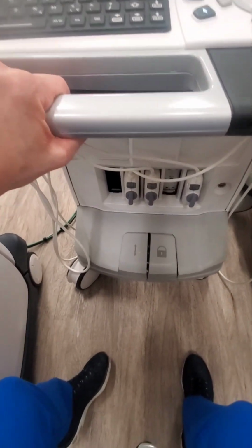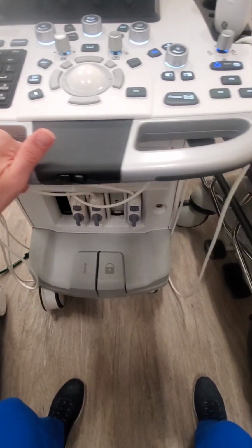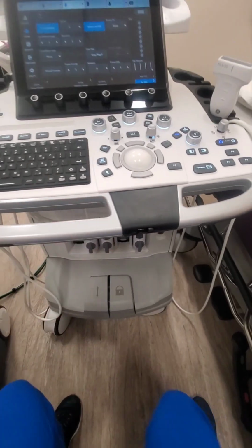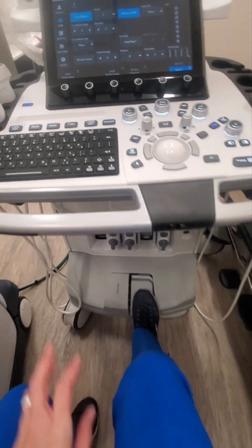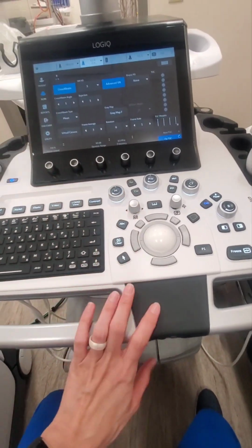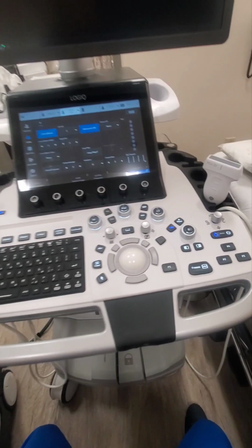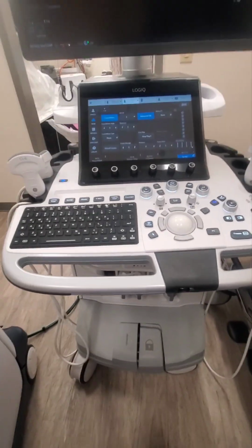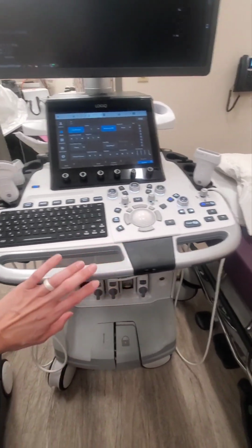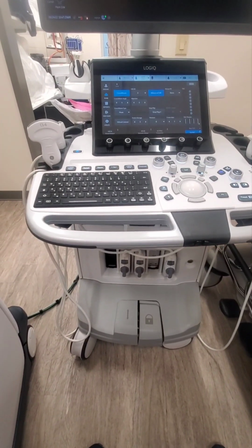When they're both released like this, then you can move the machine side to side and adjust it, get it next to the bed, and then you can lock it so that it's held in place. So, as you're pushing on it and moving things and guiding an interventional procedure, your machine doesn't roll away from you, right? Okay, so the console, the foot pedals.